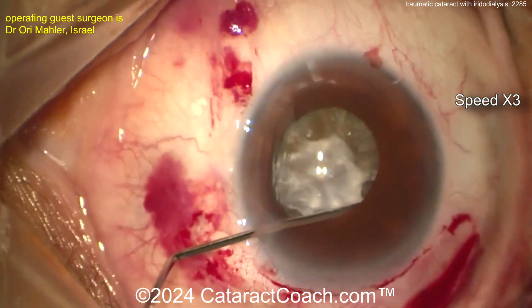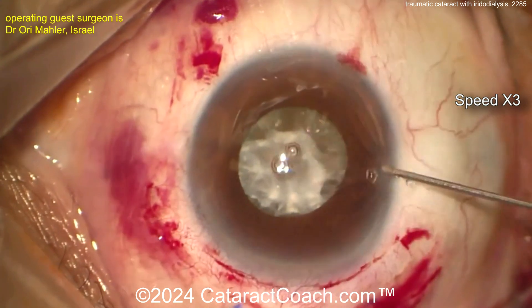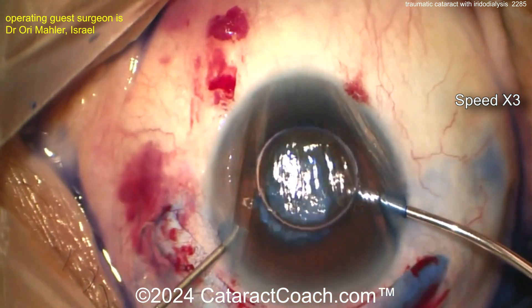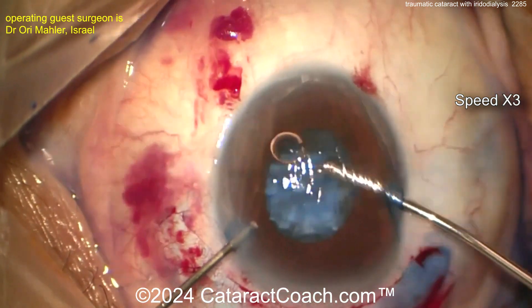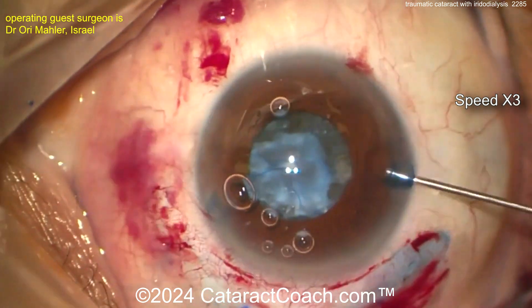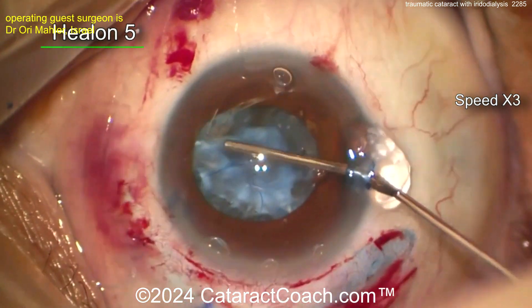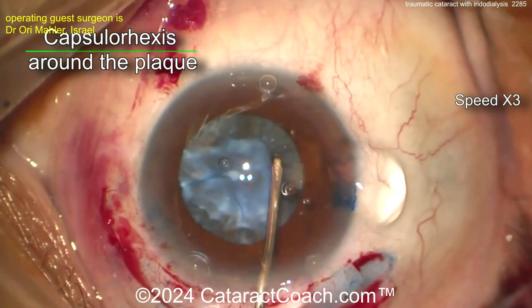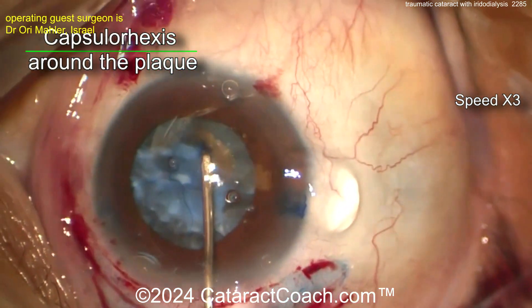Going inside here, just examining what's happening. You need a little bit of trypan blue dye. Be careful — if there's no lens, then when you put in a lot of trypan blue dye it can be pushed back into the vitreous cavity, and as we know you may lose your red reflex. Here comes the viscoelastic. Yeah, it looks like a fibrotic capsule too, so some serious trauma. 2.4 millimeter incision.